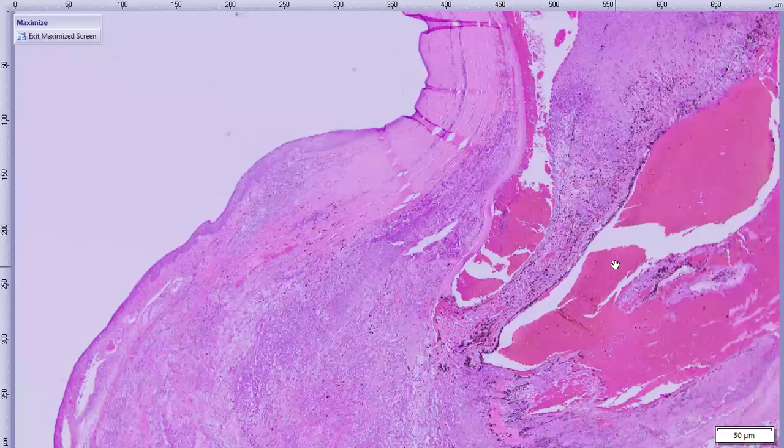And the dog also has something going on in the liver and spleen, and those were FNA'd as well, and they just say that it was benign. So I'm not sure exactly what those findings were. But the statement that they made was a little bit confusing to me, but they say that being that lymphoma was not diagnosed on cytology of the mediastinal mass, they suspected thymoma.